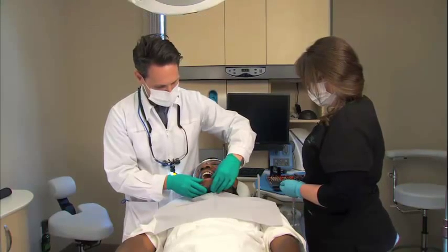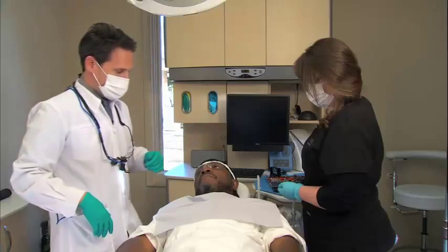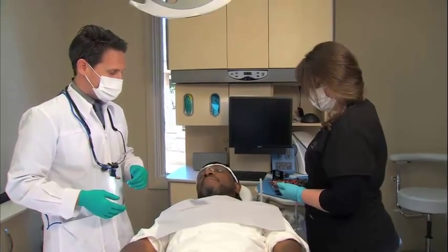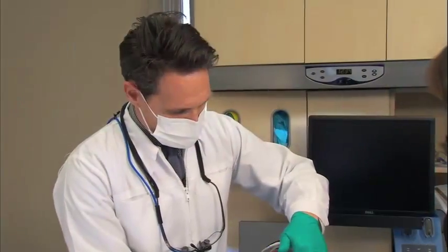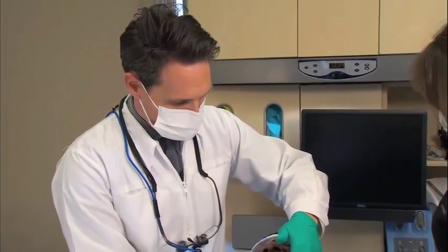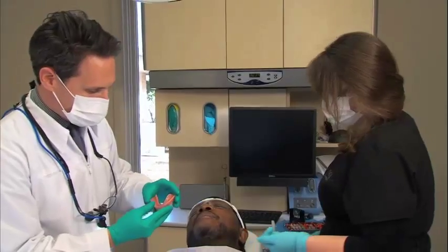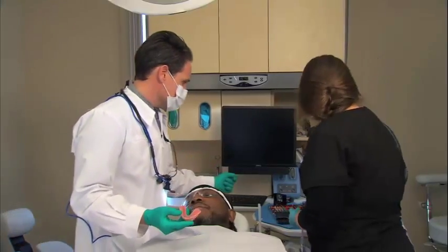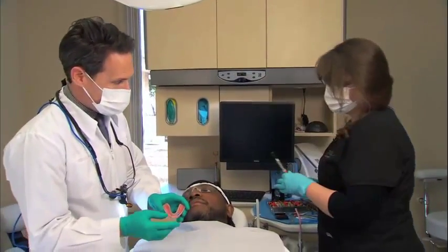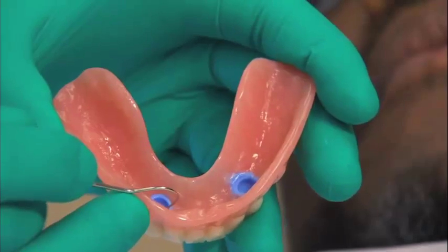I'm going to seat that with gentle pressure and have Byron close together gently. This material sets up fairly quickly — normally ready to remove in about 45 seconds to a minute. We'll have Byron open and check our clearance by removing the denture. What we're looking for is any area where we can see through to the acrylic. We actually have great areas of material coverage around both attachments — you can see a nice ring of blue around each area.